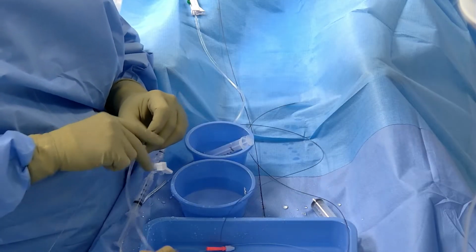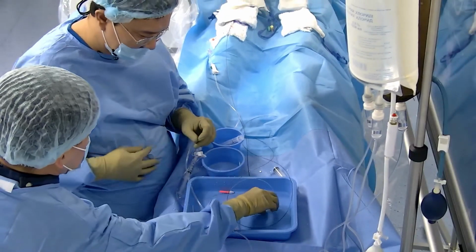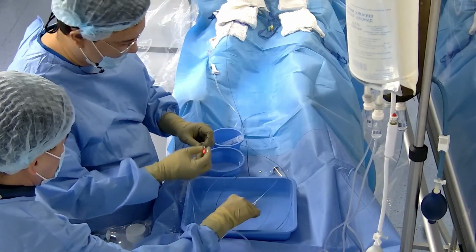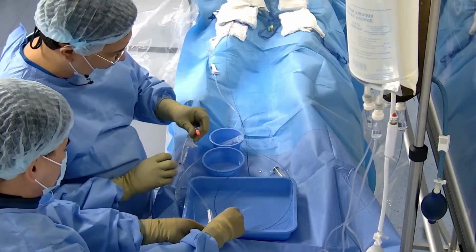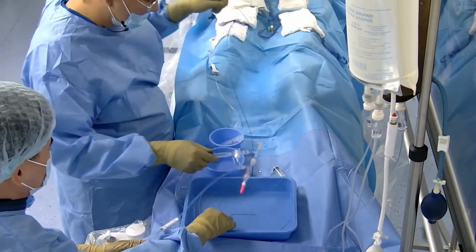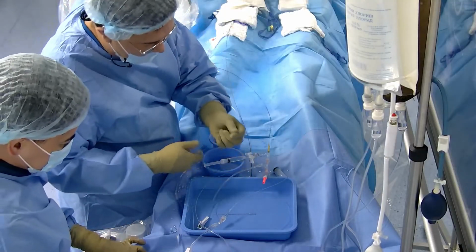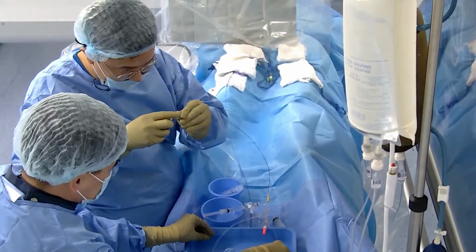And if the balloon is properly prepared, then everything is okay. If it's not properly prepared, then the visibility of the balloon will be worse, and it may cause complication. You may rupture the artery.